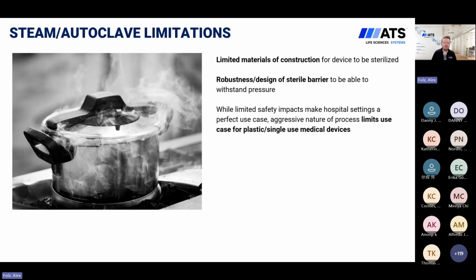Working at ATS, working through quoting automation for a lot of medical devices, I've worked on one or two applications where some of the process parameters for the device weren't necessarily a requirement for the end patient. They were a requirement for the device to be able to withstand steam sterilization, right? So in some cases, you're impacting your product design to enable the device to be steam sterilized. So certainly a high barrier of entry to allow for steam sterilization there.